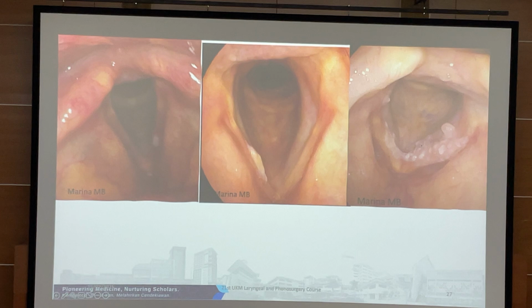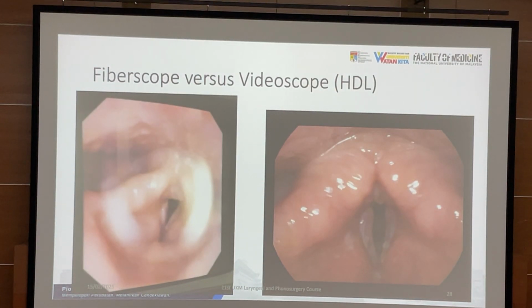How about that one? The patient is a doctor, who claimed, oh, this is just a leukoplakia, don't do anything, because I had the same surgery 5 years ago and it was reported as leukoplakia, just dysplasia. But I told the patient this is irregular, and I will show later on there is change of vasculature, and I convinced the patient to have the surgery, and it turned out to be squamous cell carcinoma. So remember I said at least you must have a videoscope.